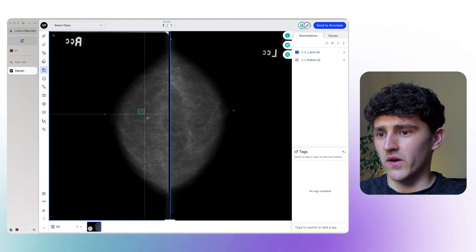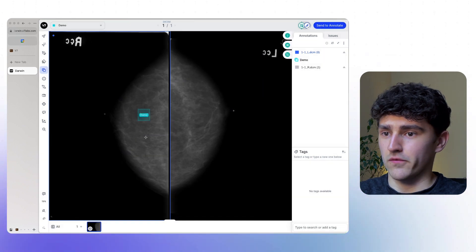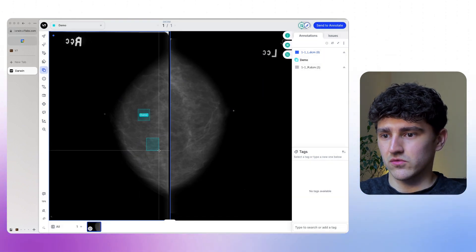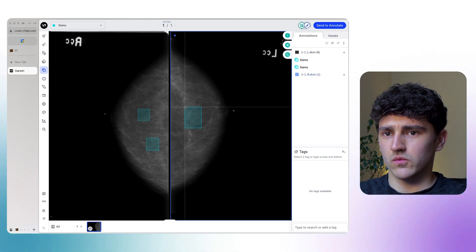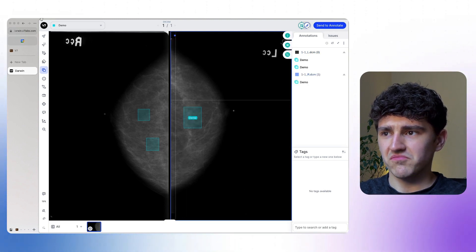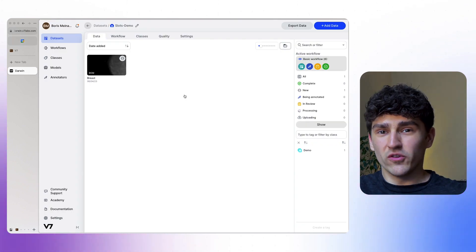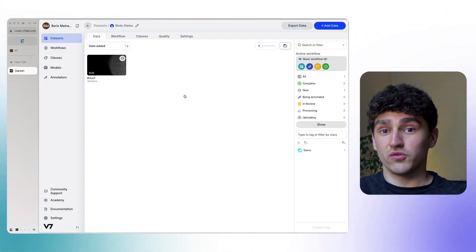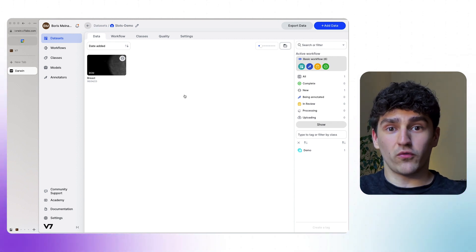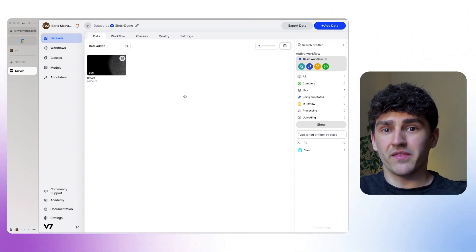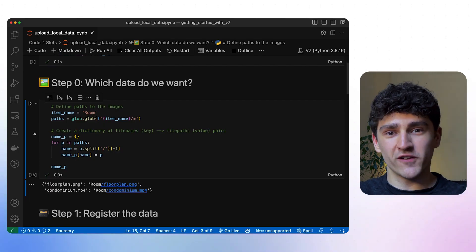One slot shows the right breast and the other the left breast, so we can compare them better when doing annotations. For instance, we could draw bounding boxes of class demo — two on the right breast and one on the left breast. Importantly, the two files uploaded into two slots don't have to be of the same type — one could be a video and the other a PNG or PDF.